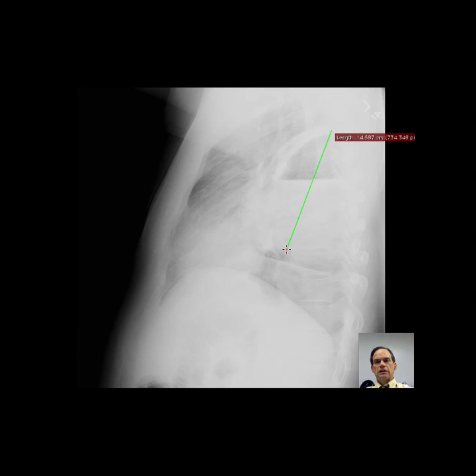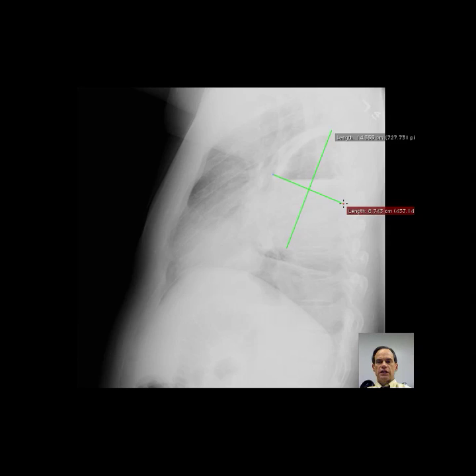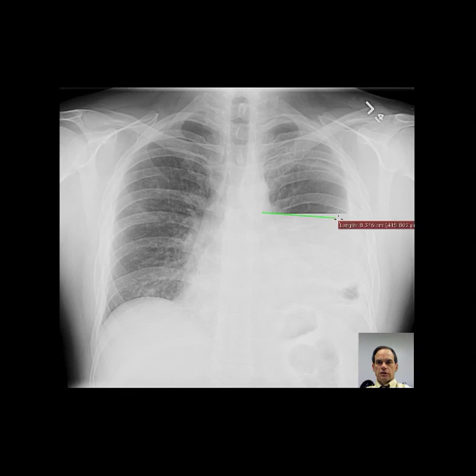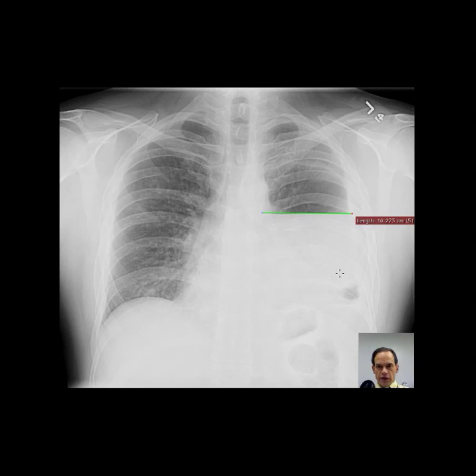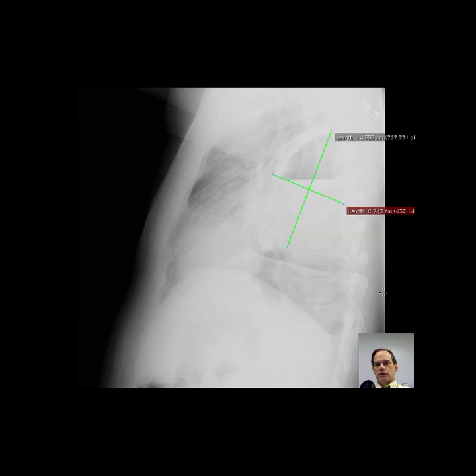The craniocaudal length of the abnormality is about 14 centimeters, compared with 8.7 centimeters in the AP direction and 10 centimeters in the transverse plane. There is preservation of a large portion of the left hemidiaphragm, particularly evident on the lateral view and to a lesser extent on the AP view. This again suggests that an intrapulmonary process is less likely than a pleural process.